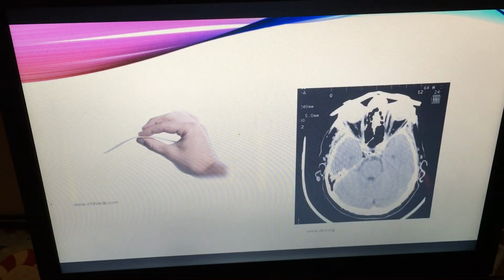In a study done to test the absorbed dose to eye lenses in head CT examinations, bismuth eye lens shields were used. The study focused on patient dose and image quality with the use of the shield. A CT-DI phantom was used with shielded eye lenses and axial scans were performed. There were 3 setups, one at 0 distance between the shielding system and the phantom, one with a 4 centimeter distance, and one without the shielding system at all.